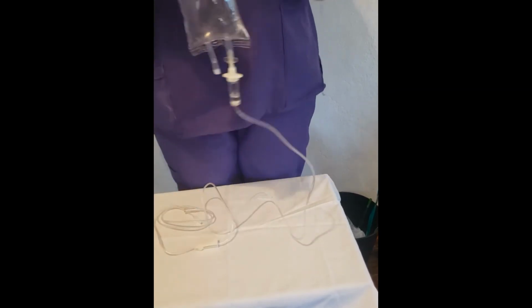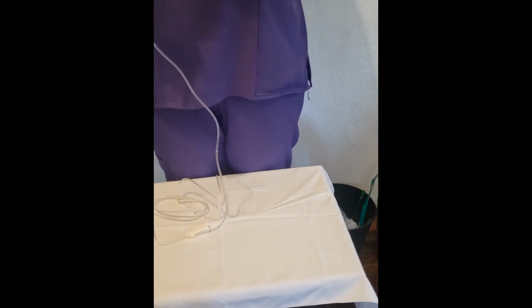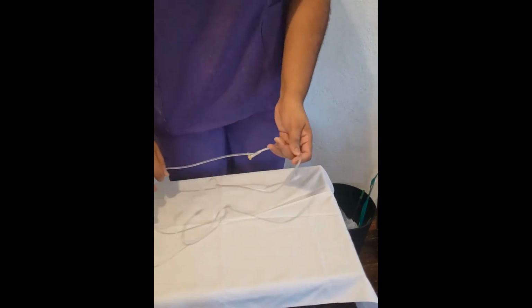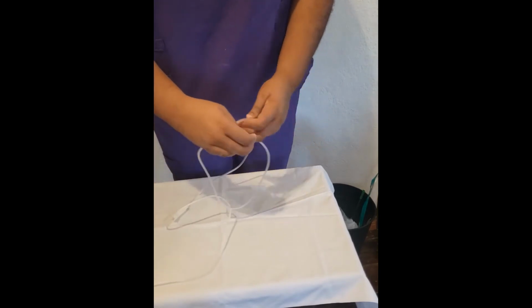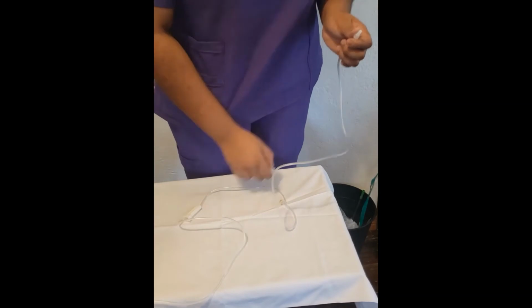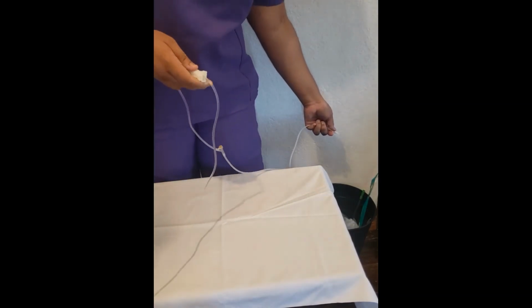Hang the solution container on a pole. Adjust the pole so that the container is suspended about 3 feet above the client's head. This is needed to enable gravity to overcome venous pressure and facilitate the flow of solutions into the vein. The roller clamp can then be opened after hanging the fluids on the drip stand to prime the tubing.